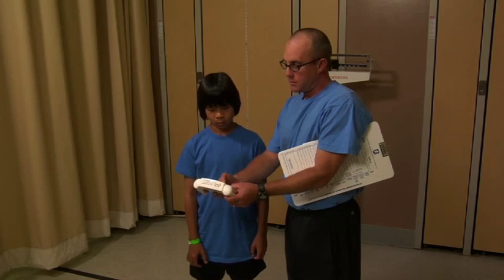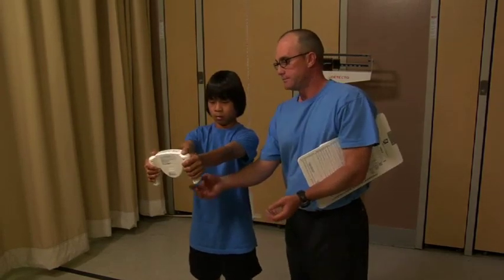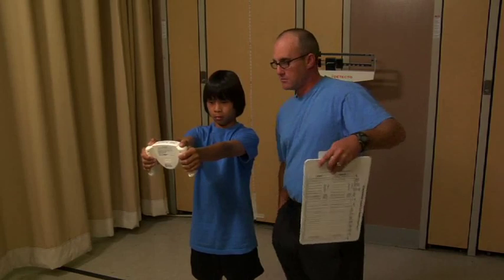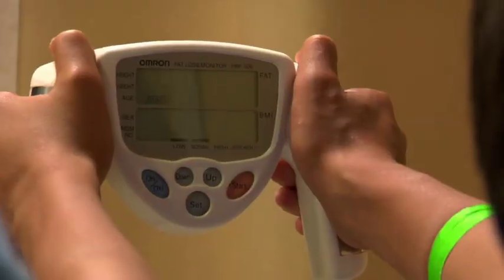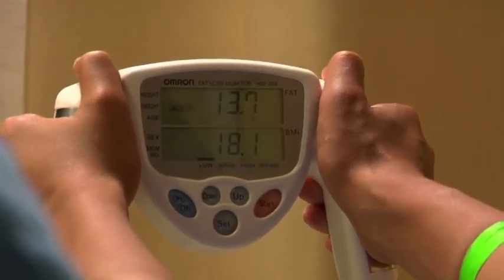To hold the device shown here, the student stands with both feet slightly apart and holds the device by wrapping the palm around the grip and placing the thumb up so it rests on the top of the grip. The student should hold their arms straight out at a 90-degree angle to the body. Once the device is started, the student should not move until the body fat score is generated.